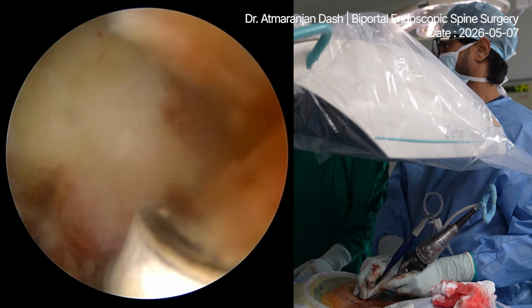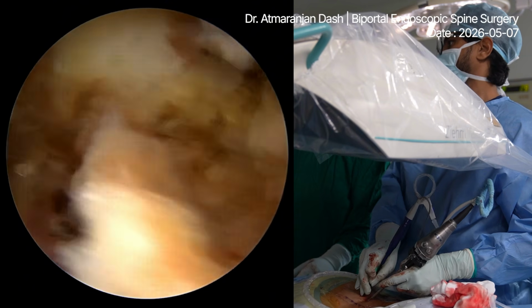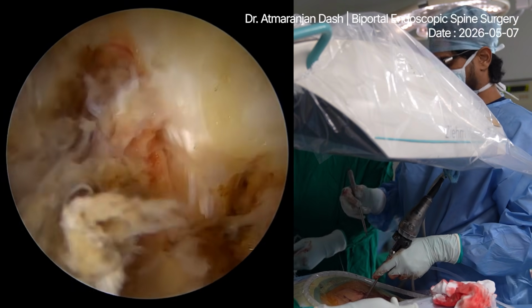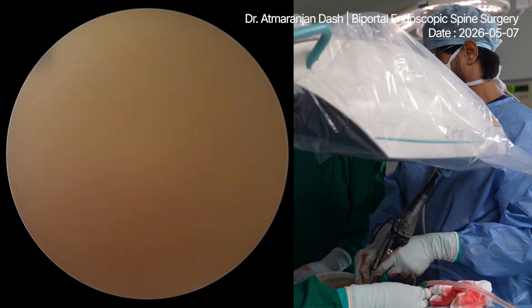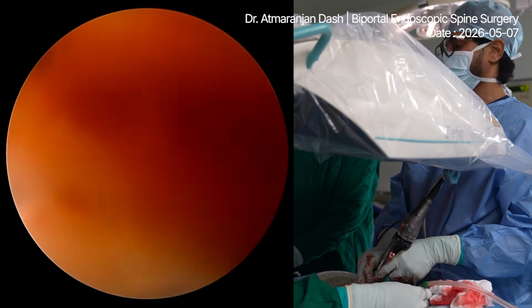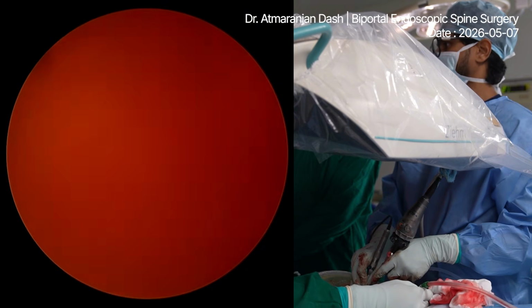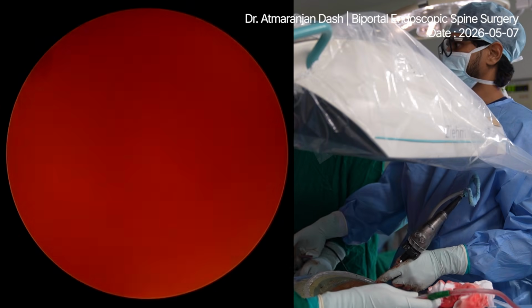So now we have identified the bleeder. You see it is here. There can be small bleeders, but when it bleeds, it looks very torrential because we are in water. Whenever we keep on drilling, coagulation please.